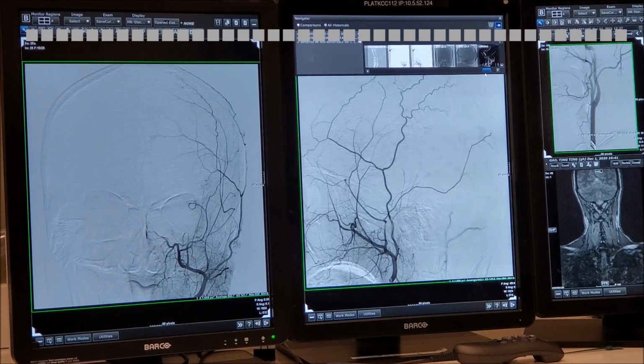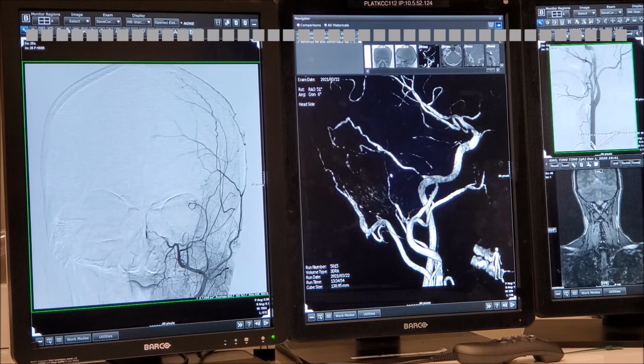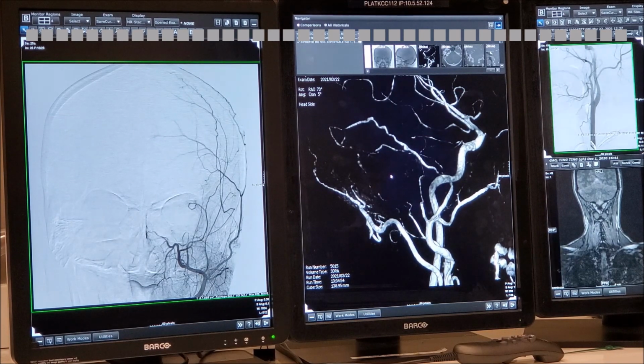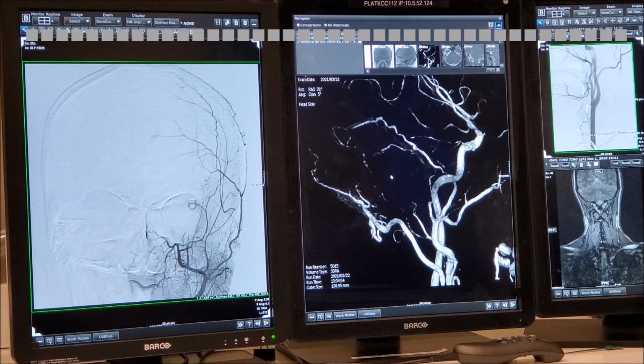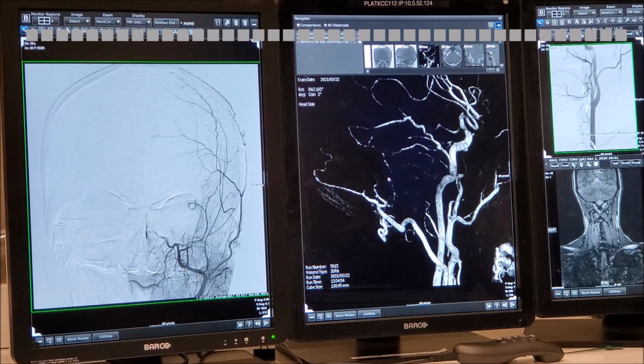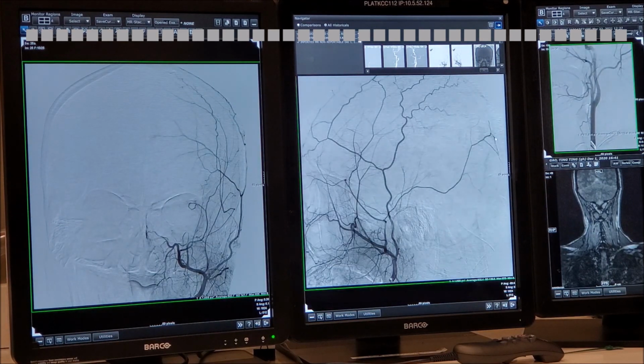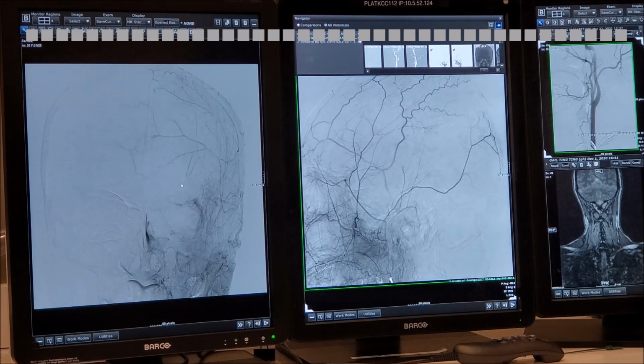Okay, so now we've got to go back to dural AVMs. I was wondering, ask me the question. I didn't hear it. So the posterior branch of the MMA goes and ends in a capillary blush. I was wondering if that is some PL contribution leading to that capillary blush. No, there's no PL. That's very rare. I don't see any cerebral arteries here. That's just the meninges.